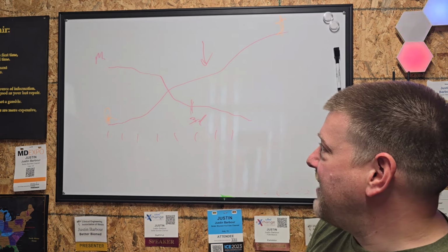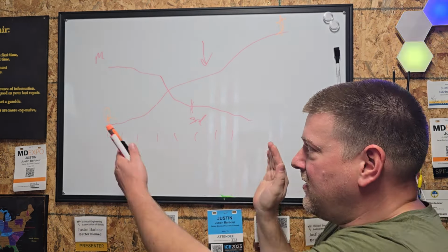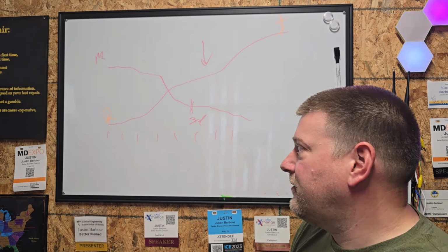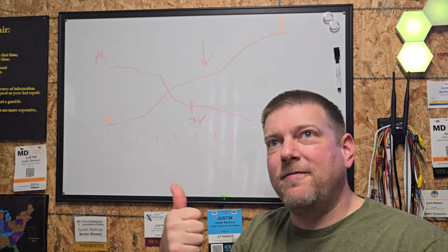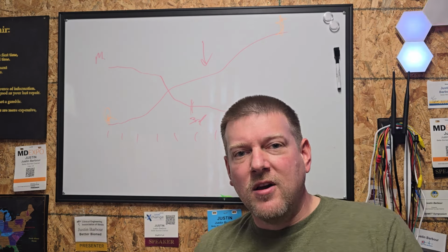So there you have it. Market value, items go down over time. You have about 7 to 10 years on the life cycle of the device, and you have a repairability cycle for the cost benefit analysis of getting something repaired. The sweet spot, 3 to 7 years.